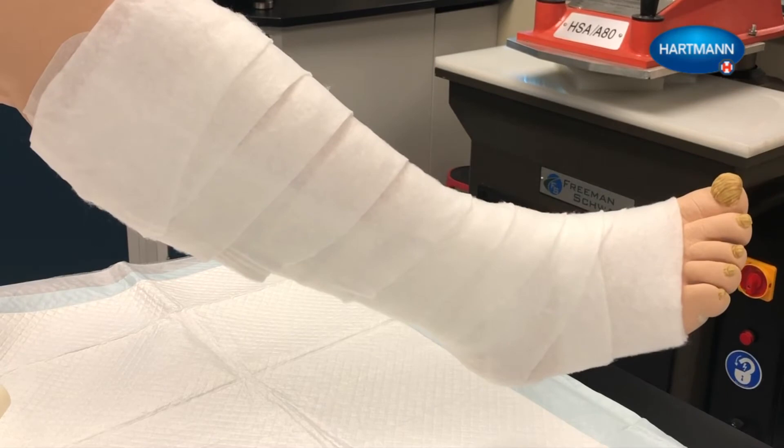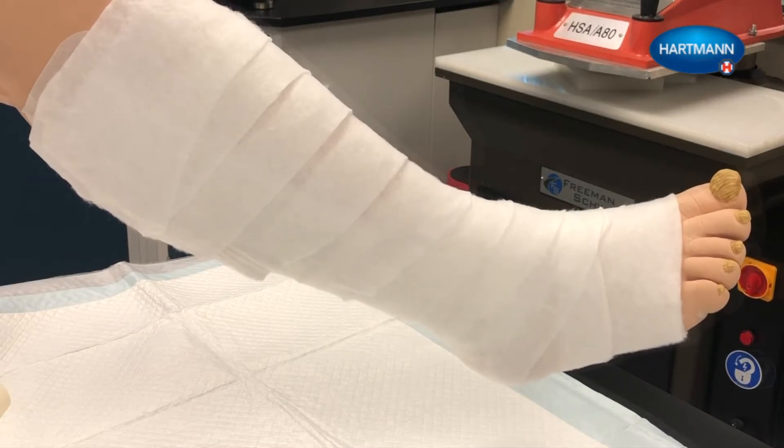Please note: when applying a compression system to the leg, it is important to enclose the heel with all layers of the system.